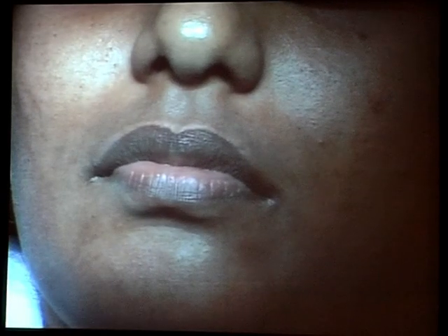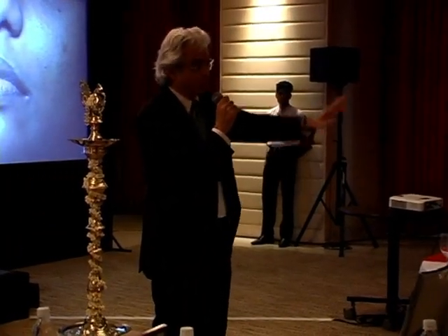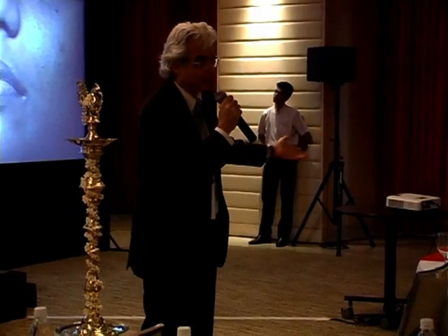Sir, one of the methods of etching the enamel for fixing the direct bonding bracket is a laser. Is it the same mechanism or something else different? Yeah, it's absolutely the same mechanism. You can even, after you've done a laser etch, either directly bond it on, or you can even etch it with a phosphoric acid etchant if you want.